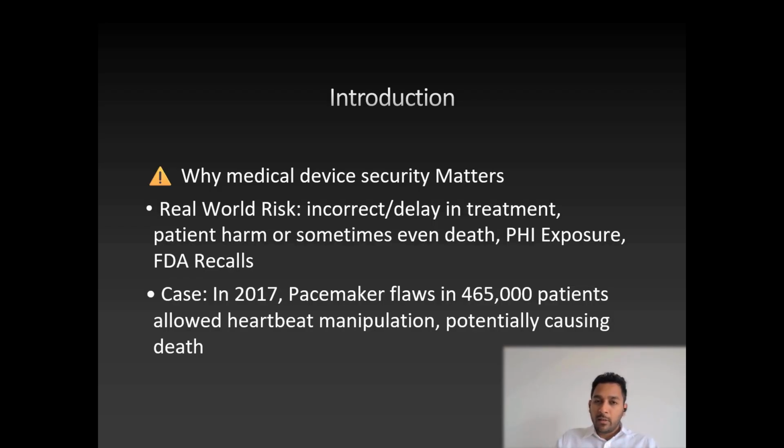If a device that's connected to a patient is compromised, for example, if an attacker could compromise the patient monitor and change the value displayed on the screen, the consequence isn't just data loss. It's much more than that. It could directly lead to incorrect treatment or delay in treatment, sometimes even death.